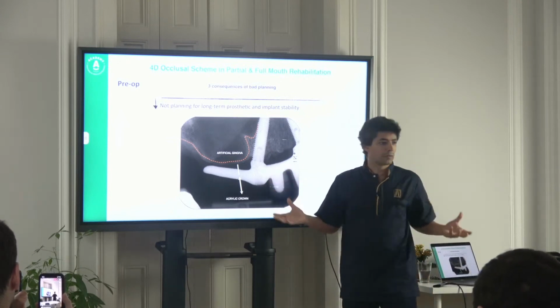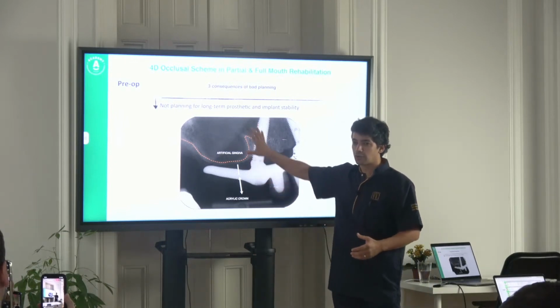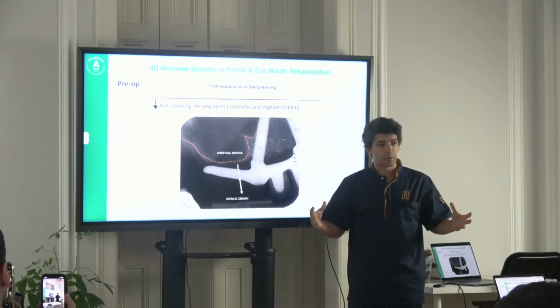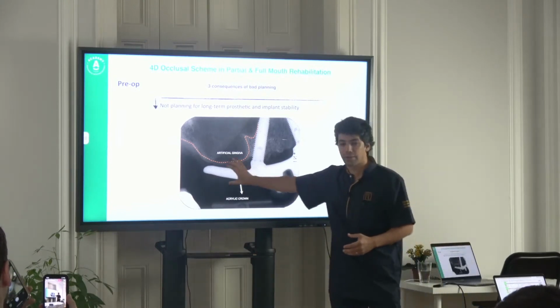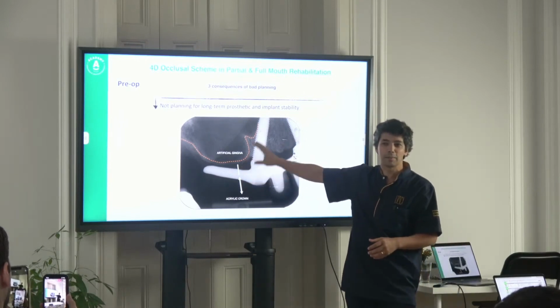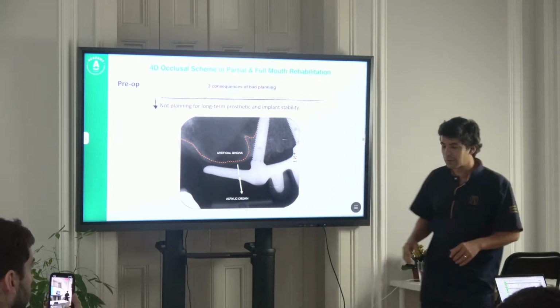Of course, here I couldn't do anything as a prosthodontist. I just had to rehabilitate. But normally we should graft the sinus and give more posterior support, and then solve this issue in a way that we wouldn't have a fragile framework that, in this specific case, even though it's titanium, was the only framework that broke on the cantilever after 3 years of usage, okay?